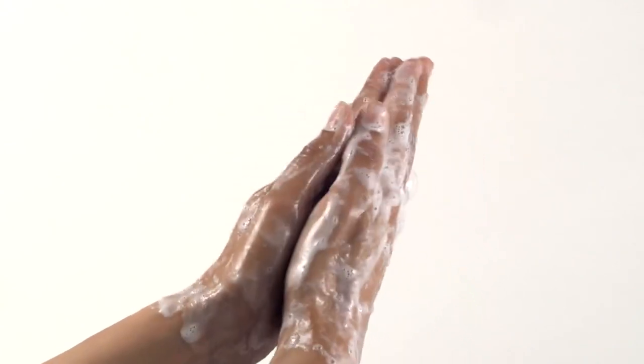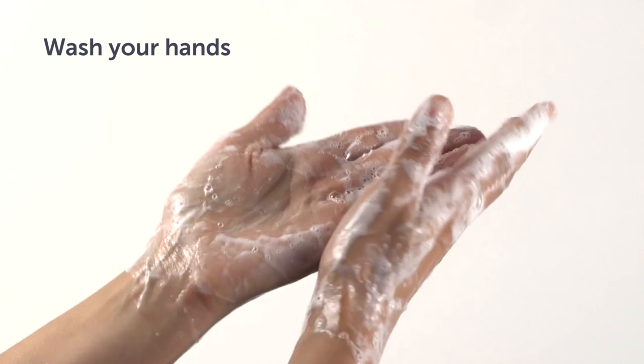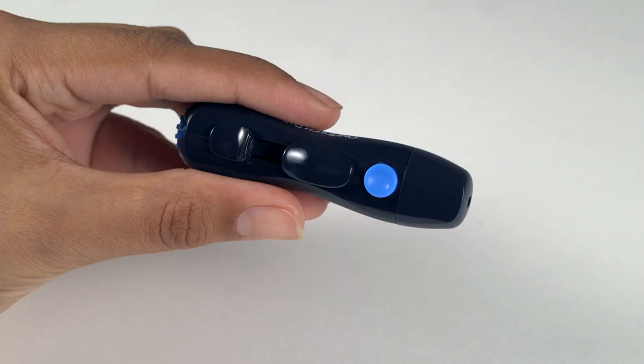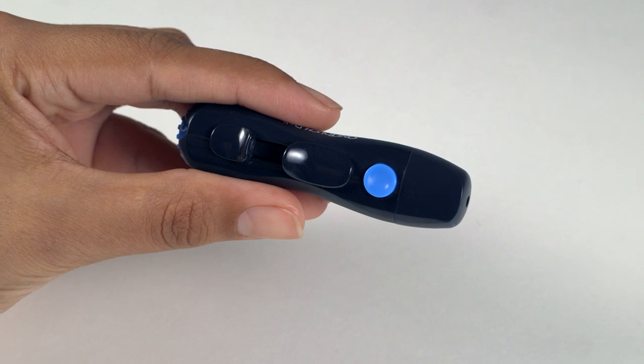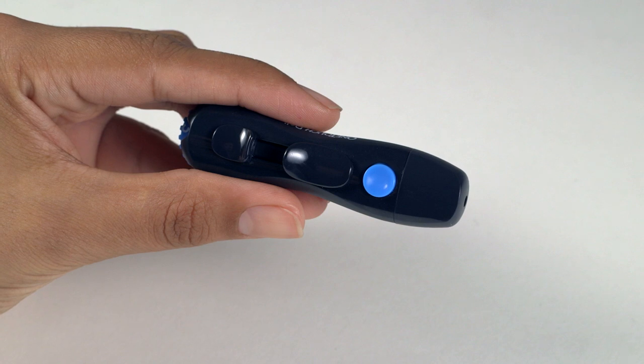To reduce the chance of infection and disease spread by blood, before testing, wash your hands thoroughly with warm, soapy water. Rinse and dry completely. The lancing device is intended for a single user. Never share a lancet or lancing device with anyone, including family members or multiple people with diabetes.